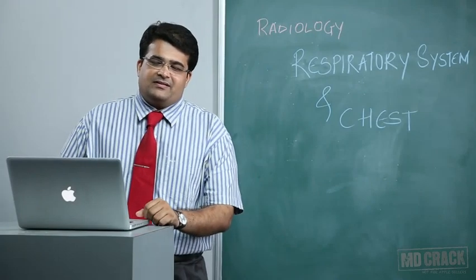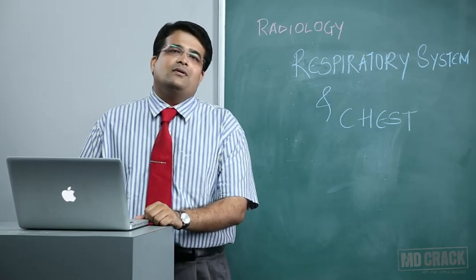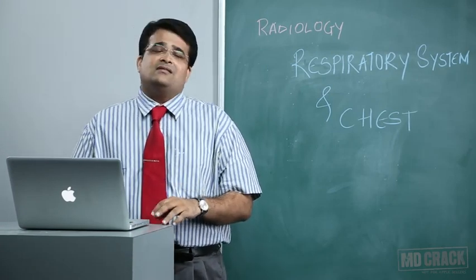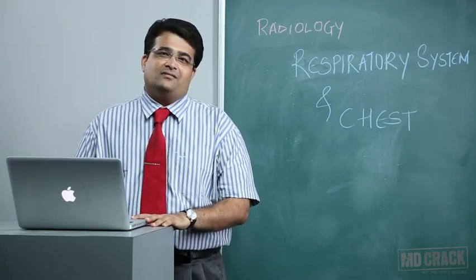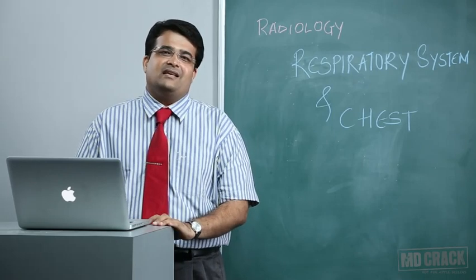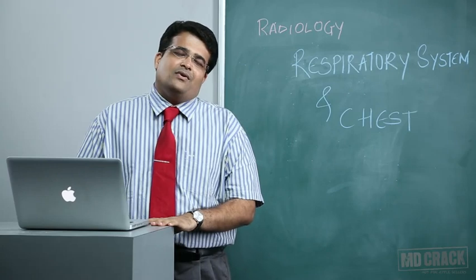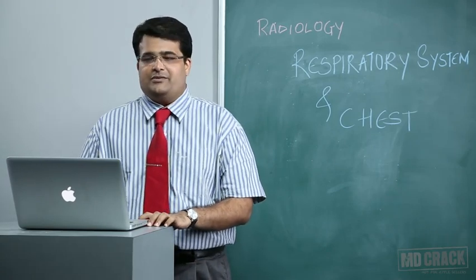Moving on to respiratory system and chest, I'd like to begin with, I would like to teach you all how to read a normal radiograph, because I think it's extremely mandatory that as a practicing physician, whether you're studying for a post-graduation exam or not, you need to at least know what a frontal chest radiograph looks like, or you need to know a basic interpretation.